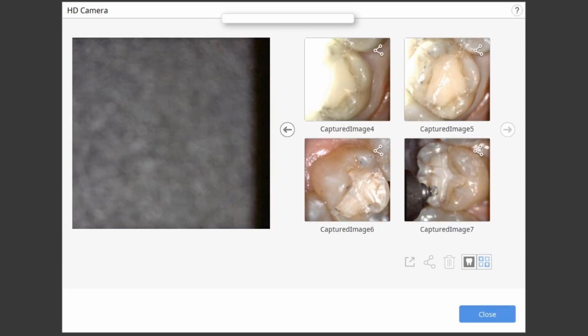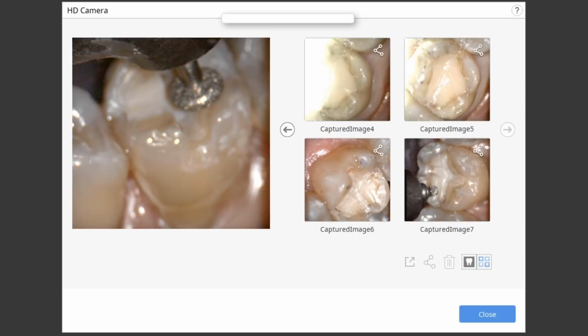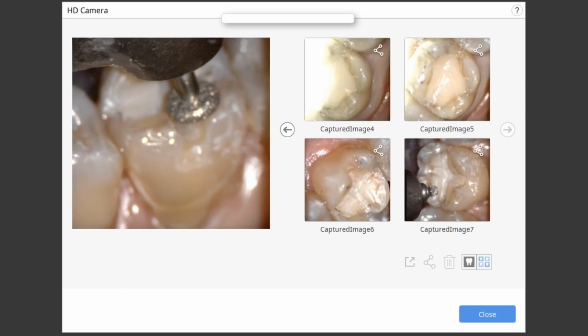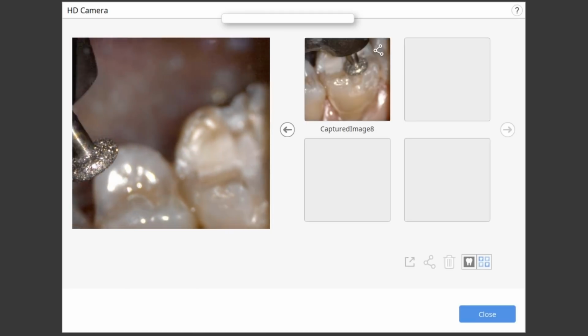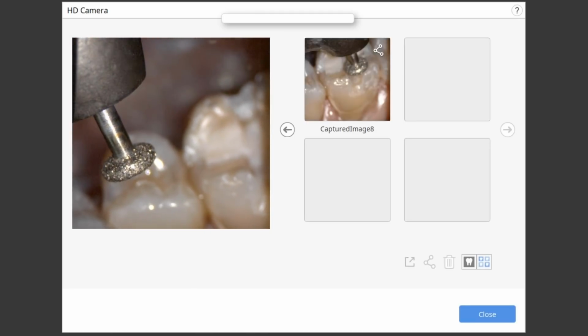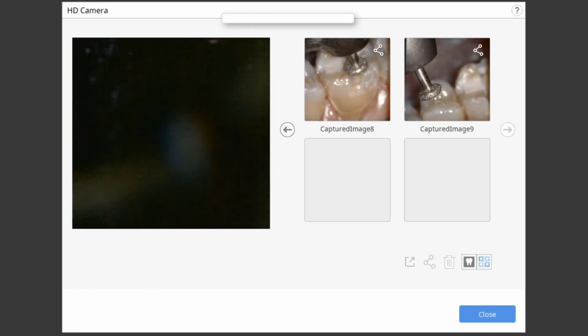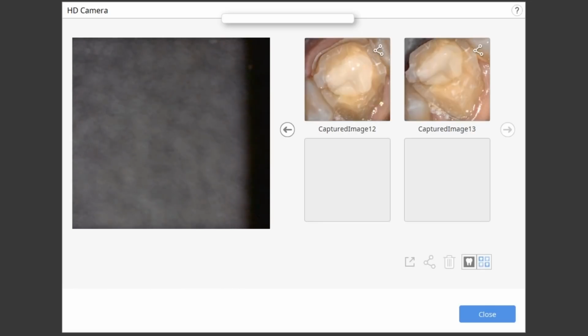Then that gives me easy access to the interproximal. It gives me easy access to the areas that are toughest to prep, which is to break the contact. So right after I follow the router burr with the flat disc, I've reduced the cusp, and I've got the clearance that I need to readily and easily access the contact area. So there's the shape of the flat disc. Take a picture of that, and we'll proceed with the modification of the preparation.